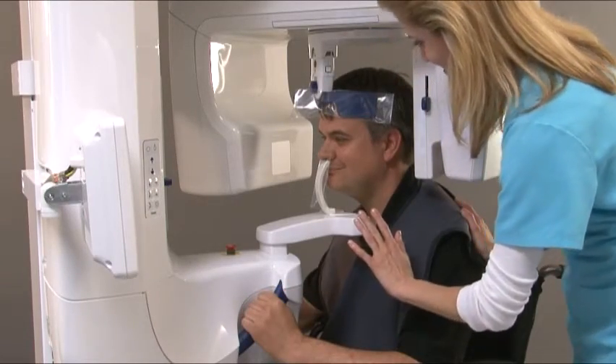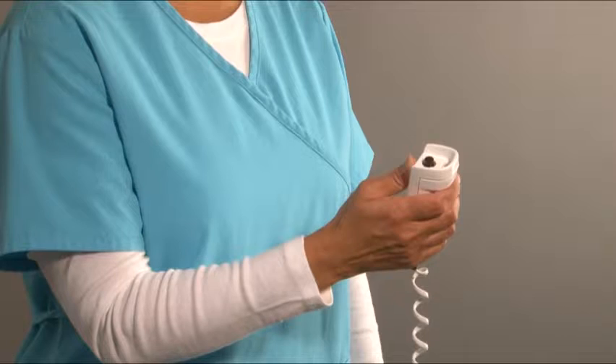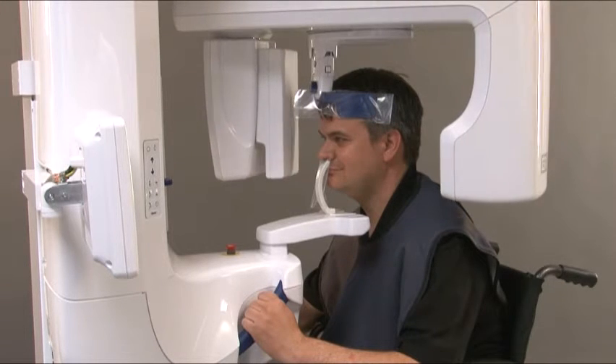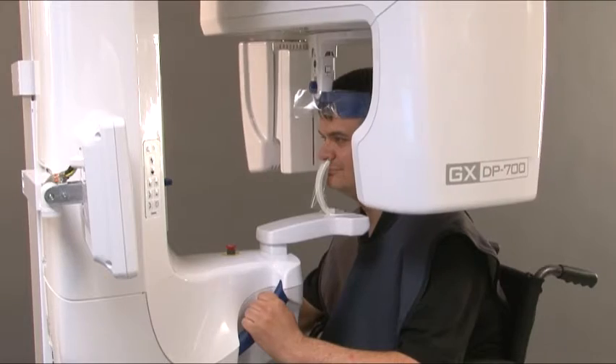Move at least 7 feet away from the unit and protect yourself from radiation. Make sure that you can see and hear the patient during the exposure. Press and hold down the exposure button for the duration of the exposure. The rotating unit will move around the patient's head and then stop. When the rotating stops, the exposure has been taken.